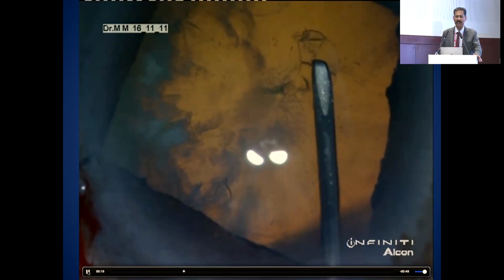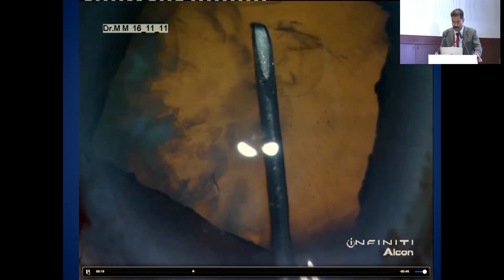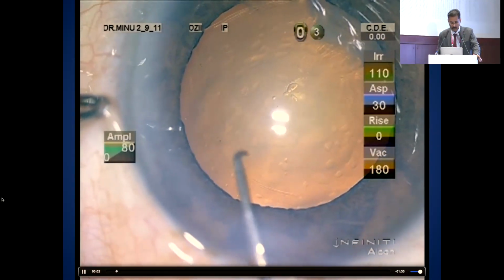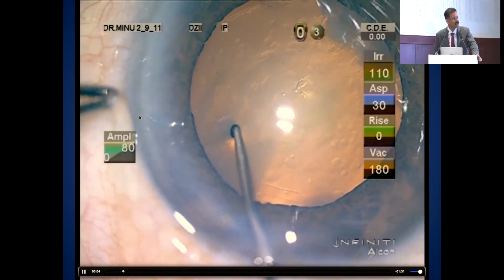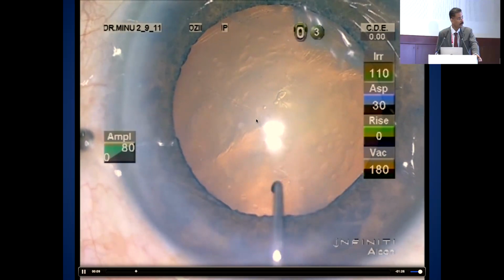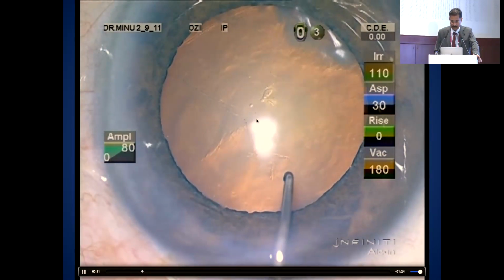It goes into that and then it doesn't proceed as we want it to. So please release the attachment in the anterior capsule and then proceed. This we have seen in quite a few cases only, but this is the regular exfoliation which you see on the anterior capsule. This is not pseudo exfoliation. This is the true exfoliation.